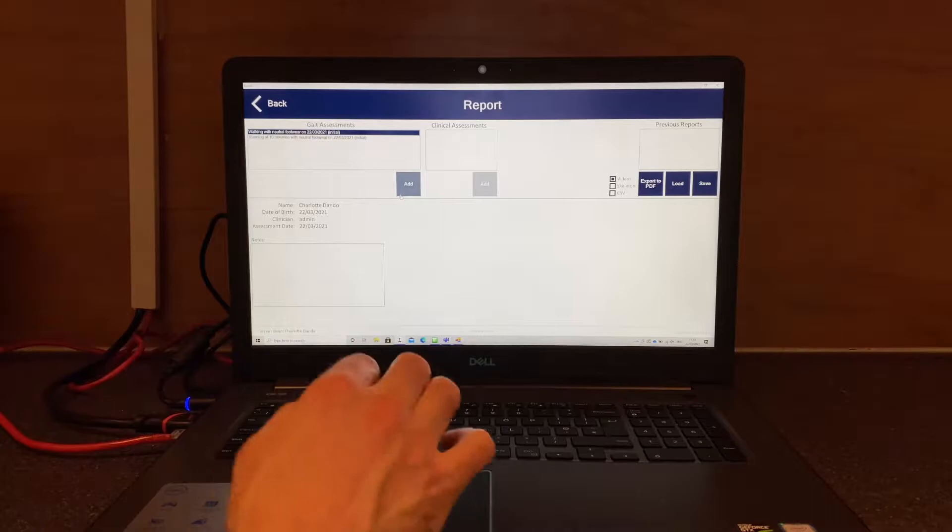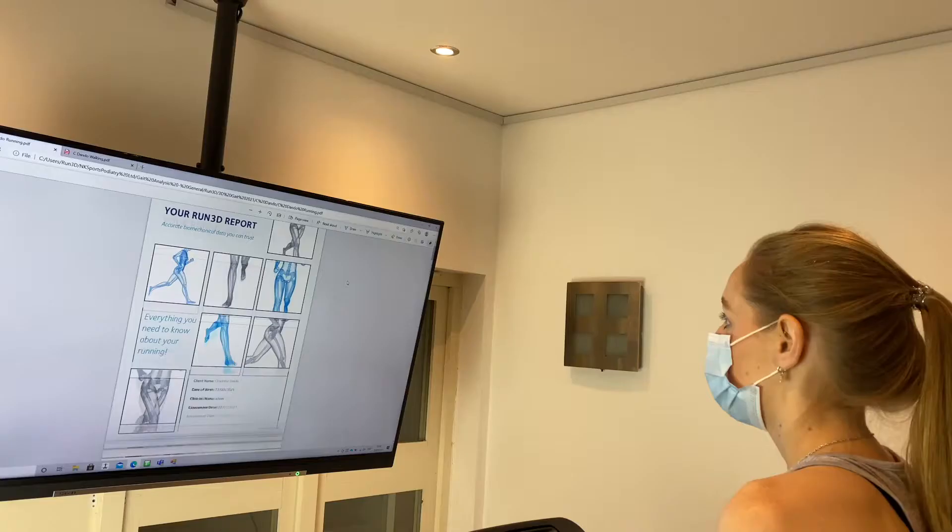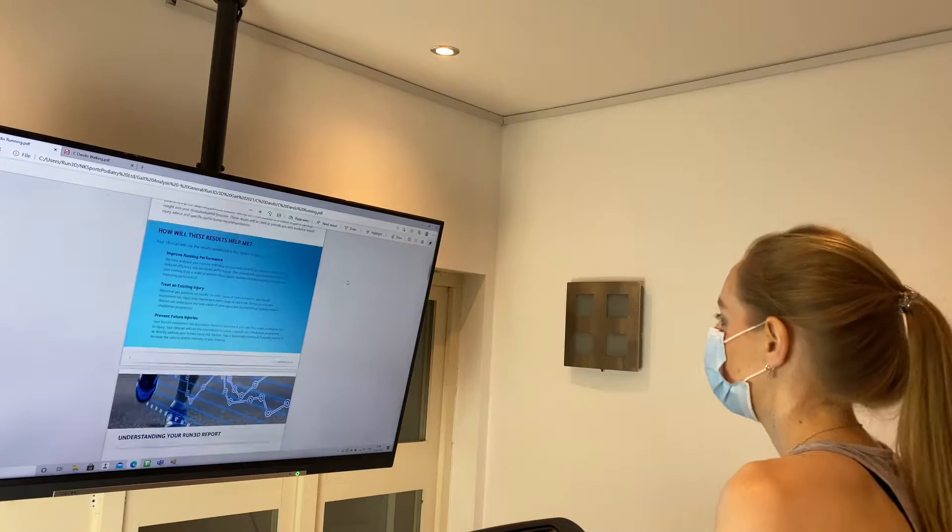The next stage is checking the data to make sure everything is smooth, and then we load everything to the report — and this is done instantly.